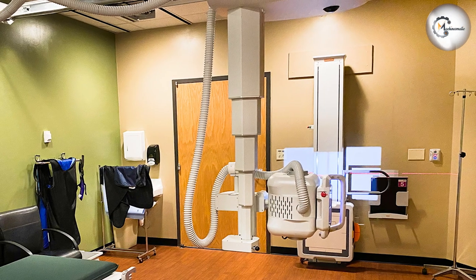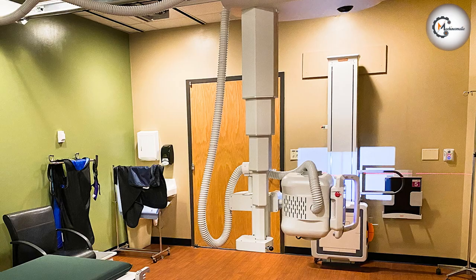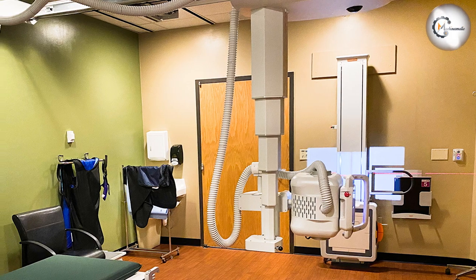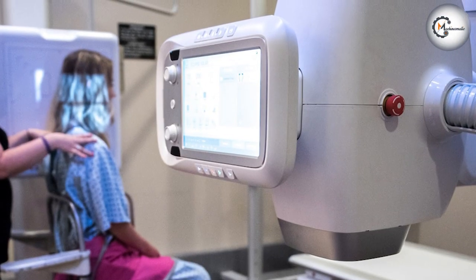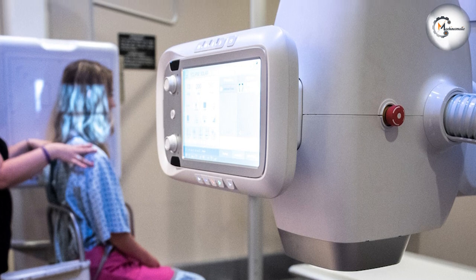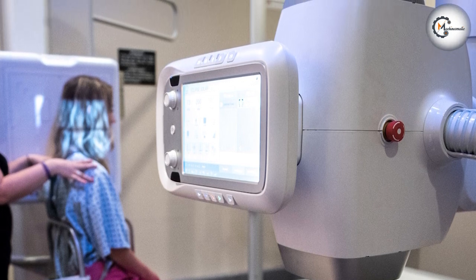Diagnosing lung conditions: x-rays can be used to diagnose conditions like pneumonia, tuberculosis, and lung cancer. Detecting foreign objects: x-rays can be used to locate objects like bullets, needles, and swallowed objects inside the body.